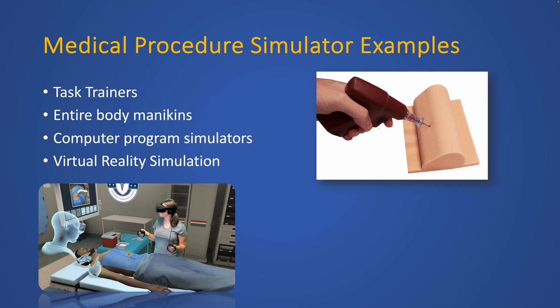Computer program simulators are interactive software programs. They can create patient scenarios and simulate procedures for the clinician. Computer program simulators are best used to aid in critical thinking and decision-making skills.